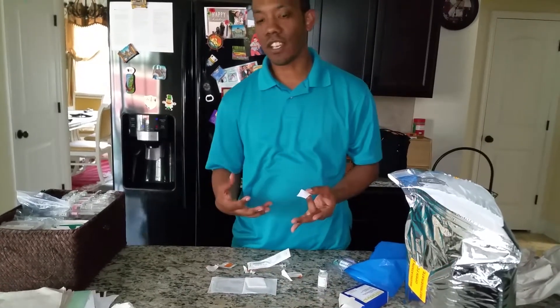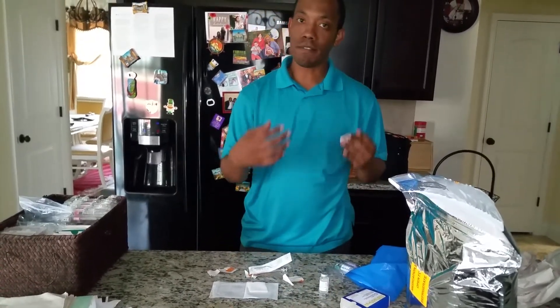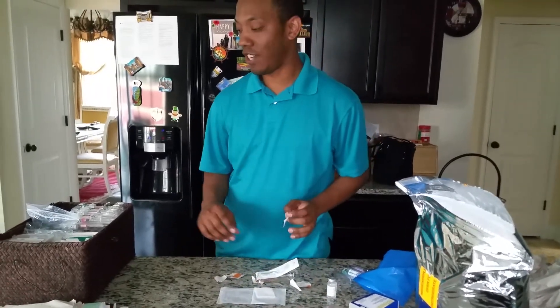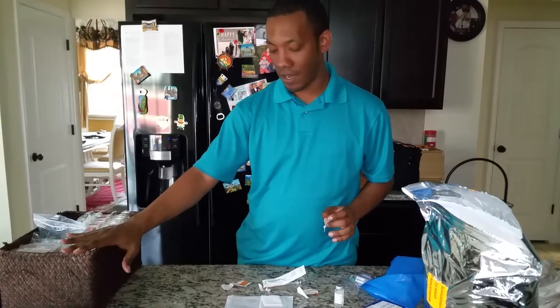We've already washed our hands. We're ready for a second shot of Lupron. I'm preparing it for my wife. Obviously, I'm not taking it because it would be something weird — I'd have to have something for the change. I've already got a needle ready to go.